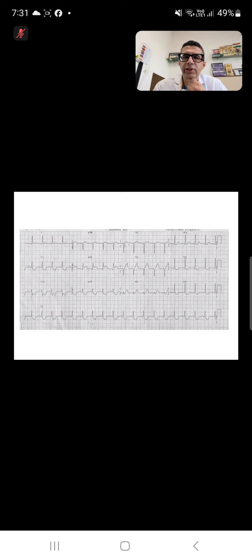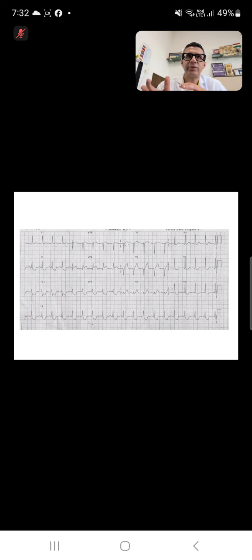Okay, so when you have ST elevation and you have ST depression, the predominant, the actual vector is always the ST elevation vector, and it's the reciprocal changes which produce ST depressions. It doesn't happen the other way around. Because of what we explained to you, how ST depression occurs and how ST elevation occurs. So if you have a subendocardial ischemia and the injury current is going away from the lead, that doesn't produce ST elevation, right? It's not enough to produce ST elevation. So always when you have ST elevation and ST depression, ST elevation is the primary abnormality, and ST depressions are the reciprocal changes. Okay.